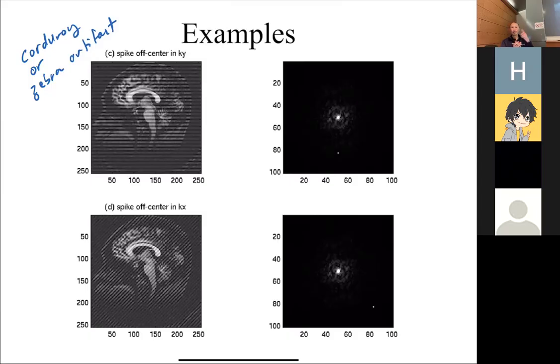Basically, as we're going through K-space, sometimes a spike will occur in the K-space. Imagine I'm going through K-space and all of a sudden I get a spike here. This is going to create this pattern in my object. For example, here, that corresponds with drawing a line to that phase, and those components. Similarly here, if the spike occurred here, then you would get that. So if you ever get an MRI and you see some stripy patterns, it just means that's what happened.